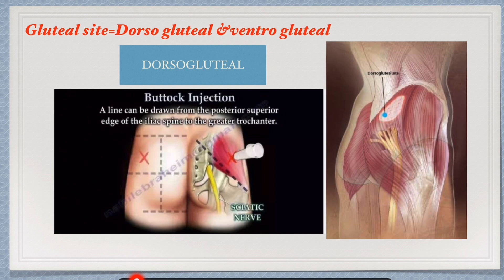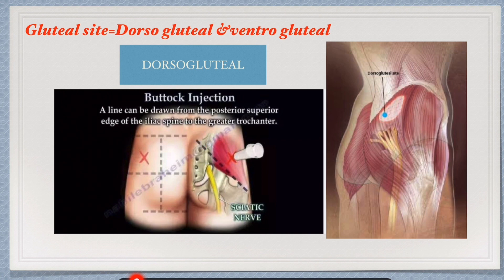To find the correct position, draw an imaginary line from the greater trochanter of the femur to the posterior superior iliac spine, and take two finger-widths above from this imaginary line. That will give the correct position for injection.